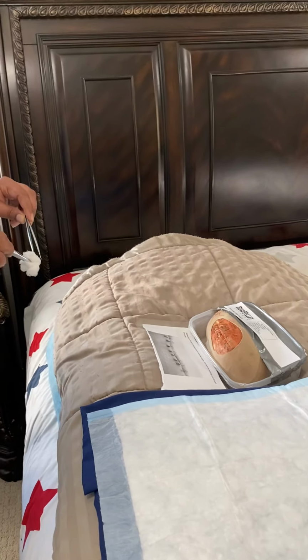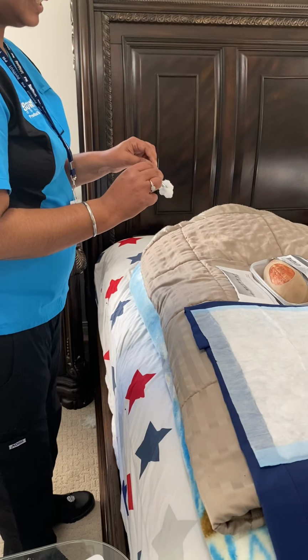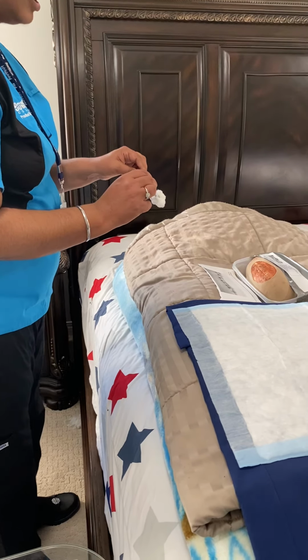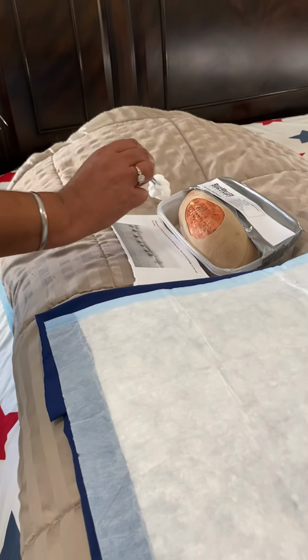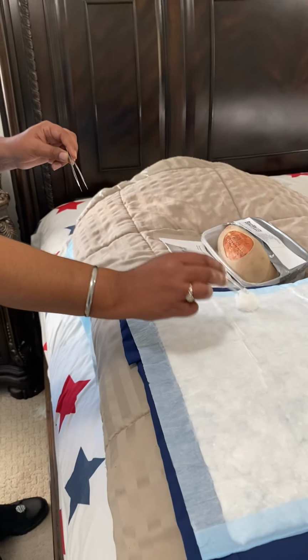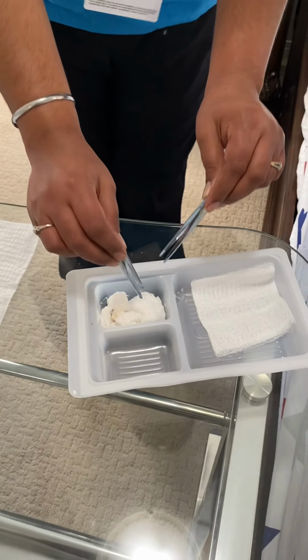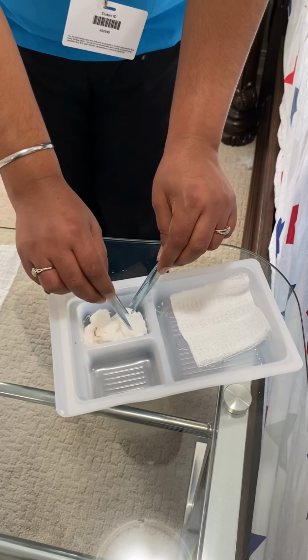So now I'm putting my forceps in a downward position because, according to sterility principle, these are wet, so to avoid contamination it should be pointed downward. So now I'm going to start to clean from the center part and place it on the side. Now the second, I'm making the pillow, second gauze.